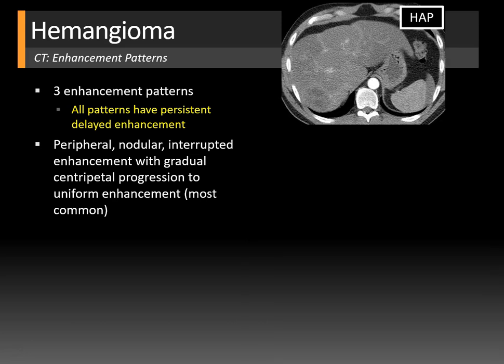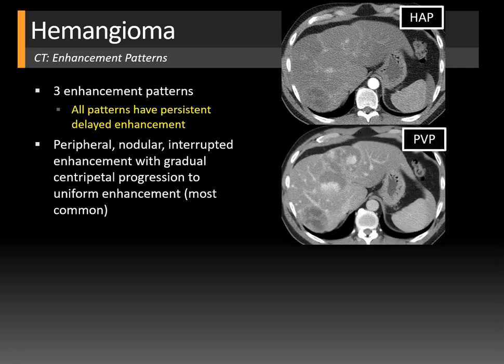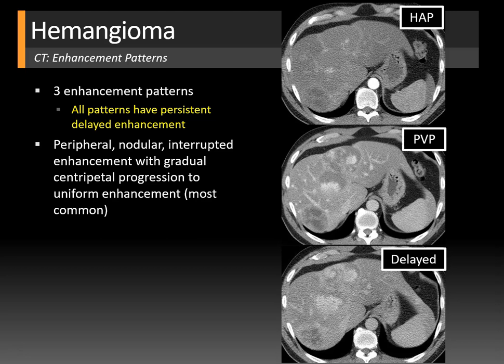Here's another example of that peripheral nodular enhancement pattern. On the hepatic arterial phase image, multiple hemangiomas show peripheral nodularity progressing centrally on the portal venous phase. The delayed image shows persistent enhancement with no washout — the lesions are not de-enhancing or becoming darker than the surrounding hepatic parenchyma.